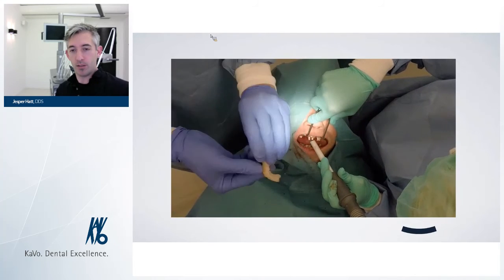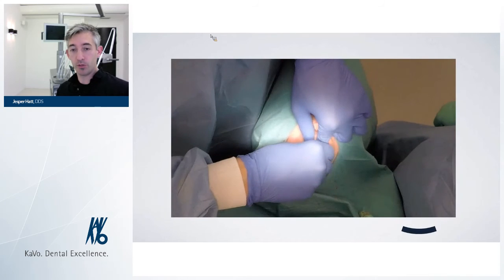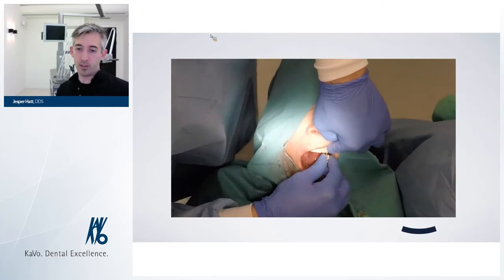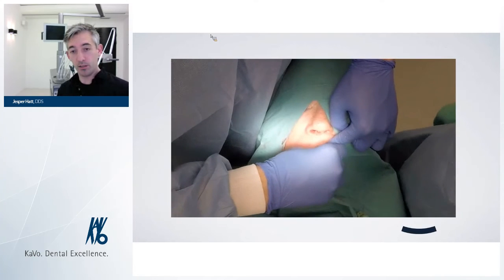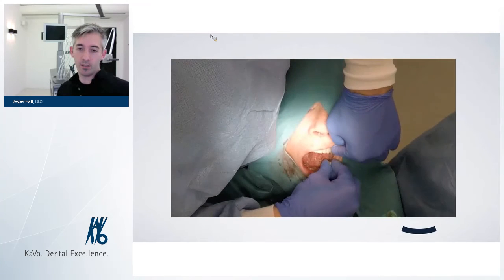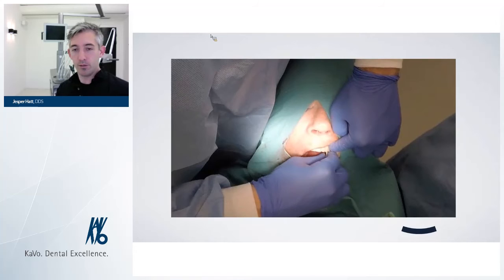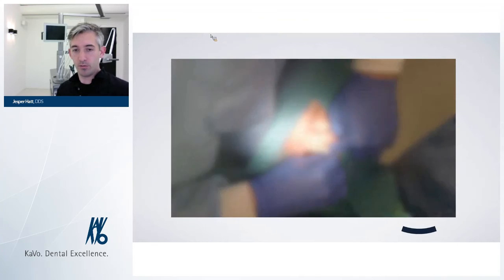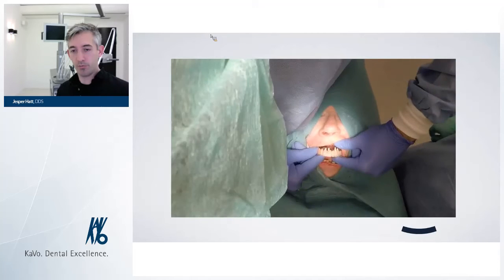and just filled our screw holes with wax so it was easy to remove them again. And of course the screw holes in the temporary abutments were filled with Teflon tape. Teflon tape is really a fantastic material in these cases. It's easy to remove. It's much easier than these pellets that we used in the old days. So this way it goes a lot easier. So we unscrew it all, and because we had our plan, it goes off pretty easily.